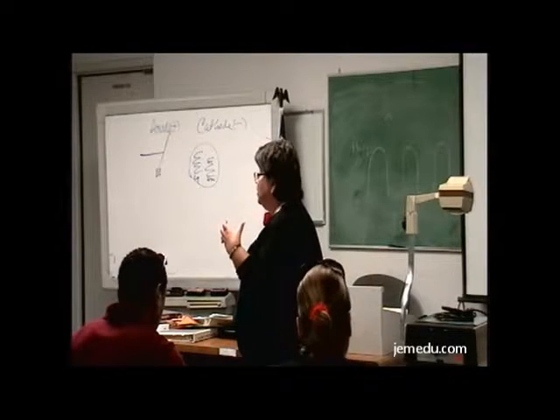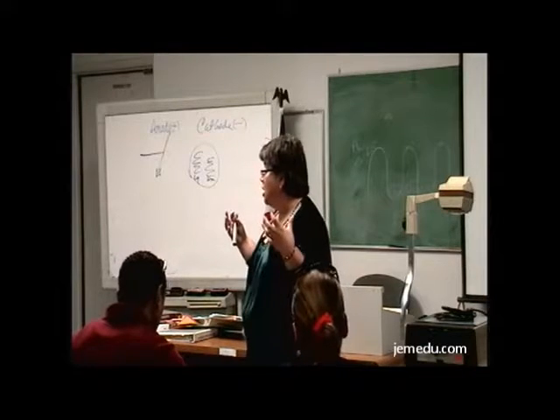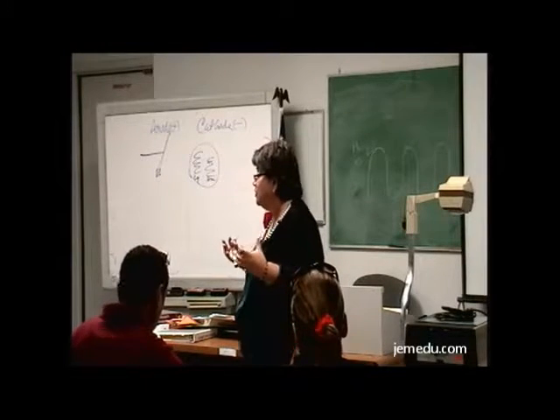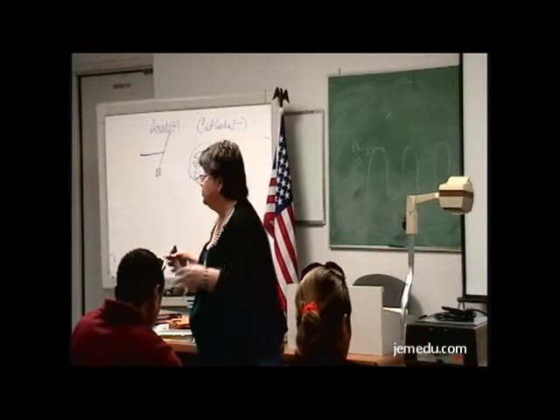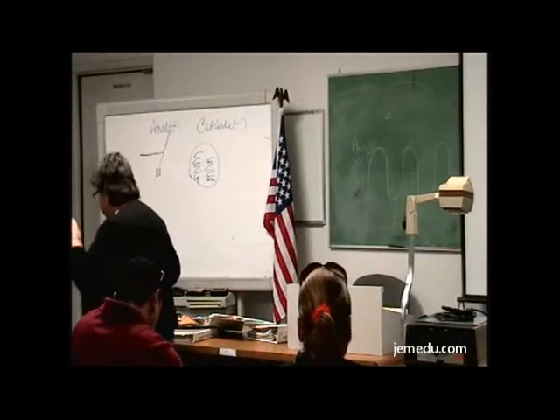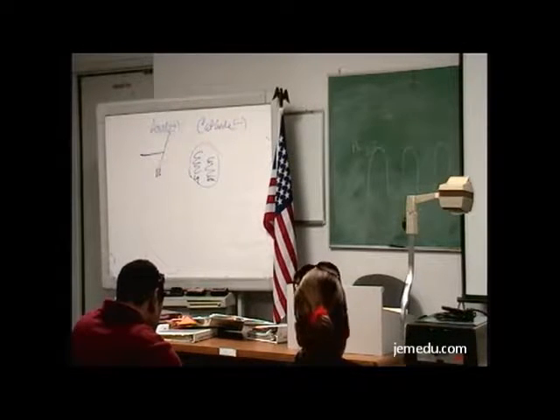They use a stationary anode because they're not using huge bombarding amounts of x-ray production like we do in general x-ray. So in certain areas we still have the stationary anode.